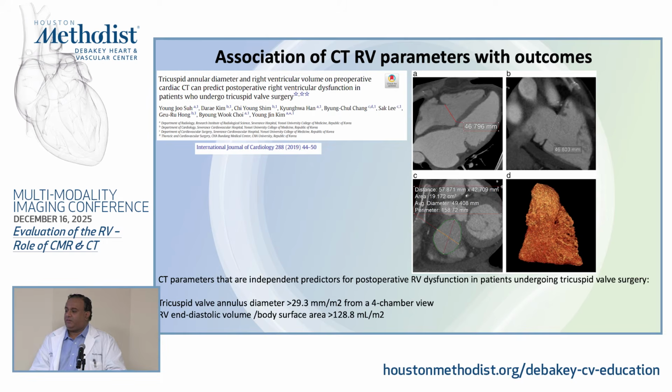This is a paper from the International Journal of Cardiology that looked at the association of CT RV parameters with outcomes in patients with tricuspid valve disease that were undergoing tricuspid valve surgery for tricuspid regurgitation.